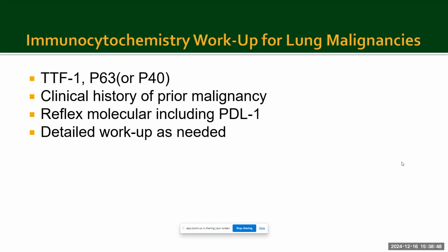Do I sometimes not do a full workup? Yes, of course, because for me my main preference is to have enough sample for molecular. If after reflexing molecular I think, or if the clinician reaches out to me to rule out malignancy, then I do not mind doing a detailed workup to reach a diagnosis. That is how I approach these cases.